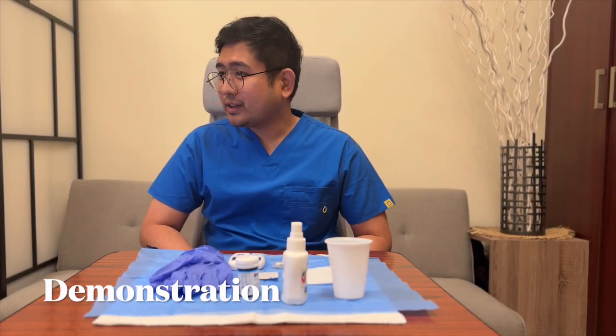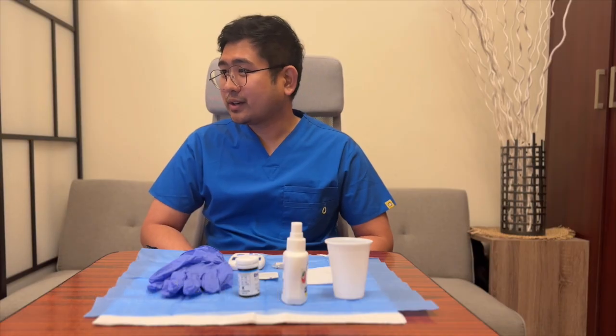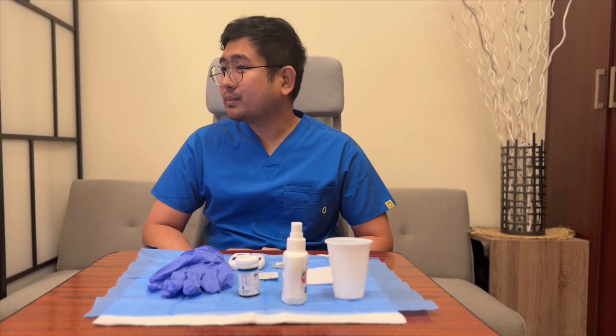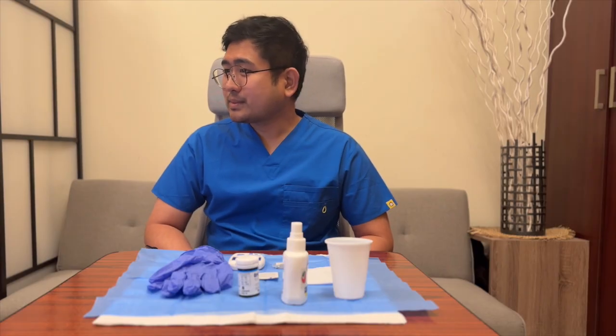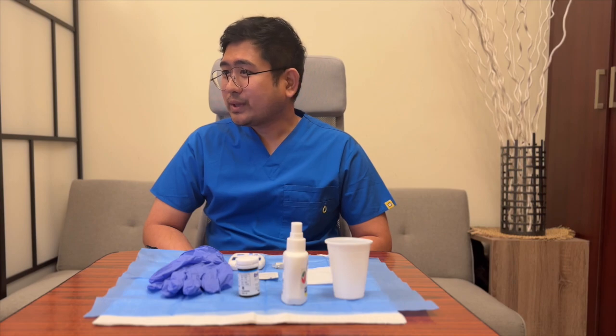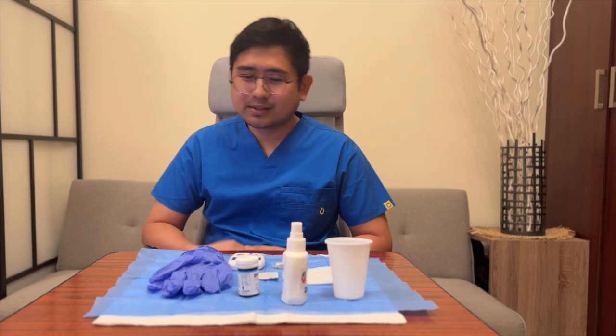Hi, my name is Gilbert. I am your nurse for today. So I'll be checking your blood sugar. This is just a quick routine finger prick test that gives you an idea of your current blood glucose level. So it's just a small prick on your finger. Is that okay with you? So I'm just going to clean my hands and put on my gloves for hygiene and safety purposes.